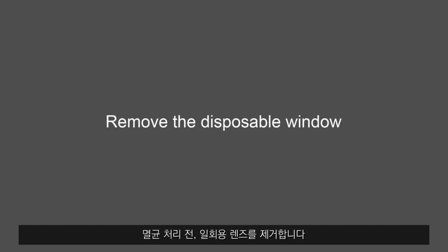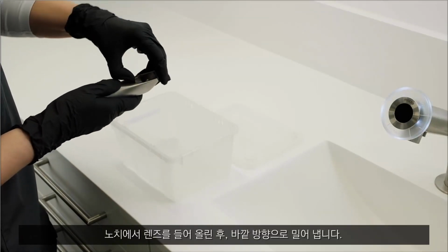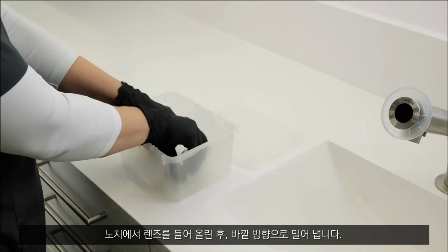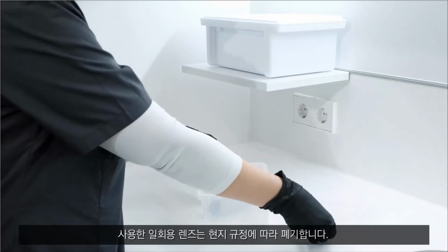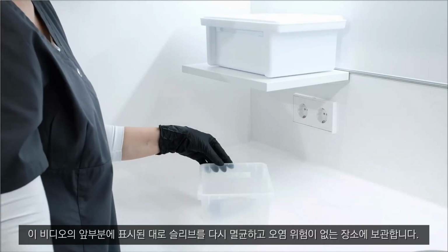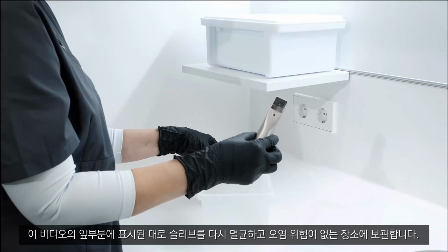Before you start the processing, remove the disposable window. Lift the window at the notch and slide it out through the guide tracks. The last step is to reprocess the sleeve. Discard the disposable window according to local regulations. Re-sterilize the sleeve as shown earlier in this video and store it in a location without risk of contamination.